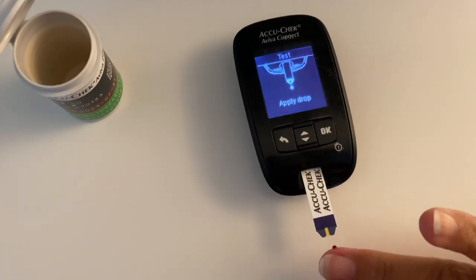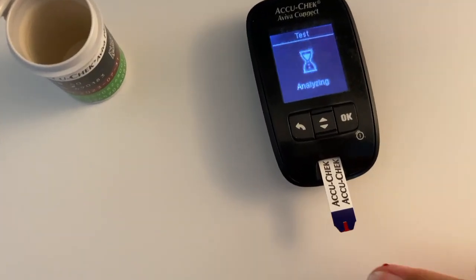I've only had 1 sensor that would not accept any form of calibration, and with that one, I had to call Dexcom for a replacement. I don't need to calibrate my sensors that often, and it's not every sensor that needs calibration. But when I do need to calibrate, it's usually in the first 24 or the last 24 hours of the sensor life. I use a meter to measure my blood sugars every few days just to check that the sensor is actually accurate, but it's definitely not an everyday thing.